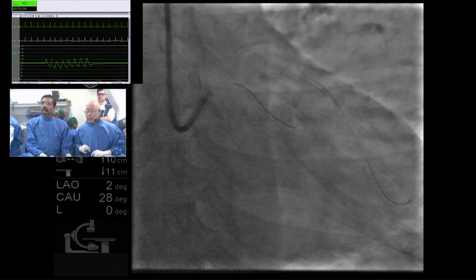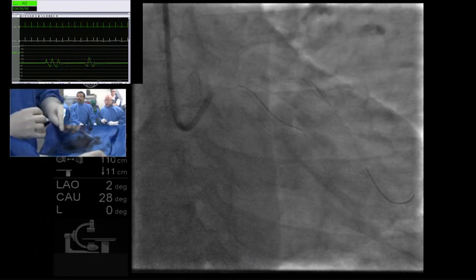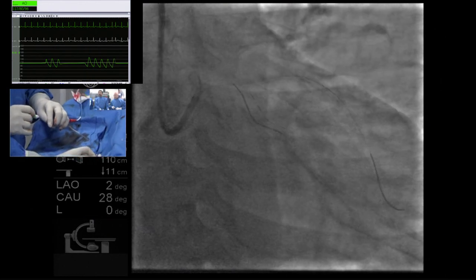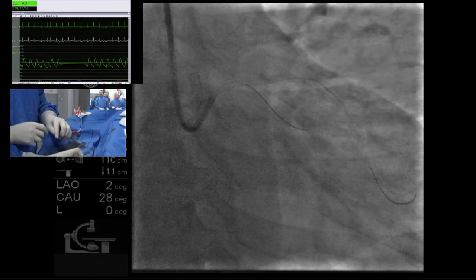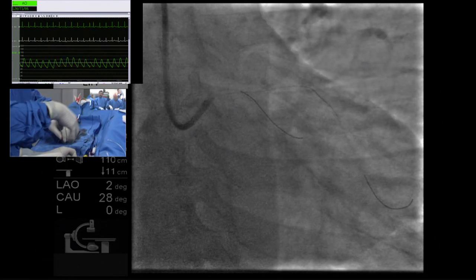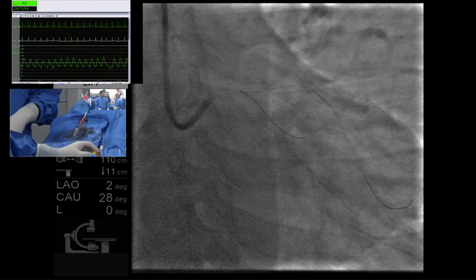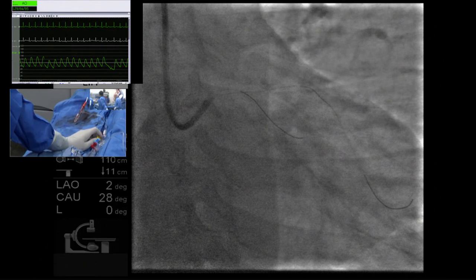Or maybe you could take a microcatheter to support this. Absolutely. That's a good idea. Yeah, absolutely. Can I have a microcatheter? I don't know if a microcatheter is here. It's not force you need in this case. It's just elegance. So the issue of the microcatheter, that'll stiffen the tip, right?